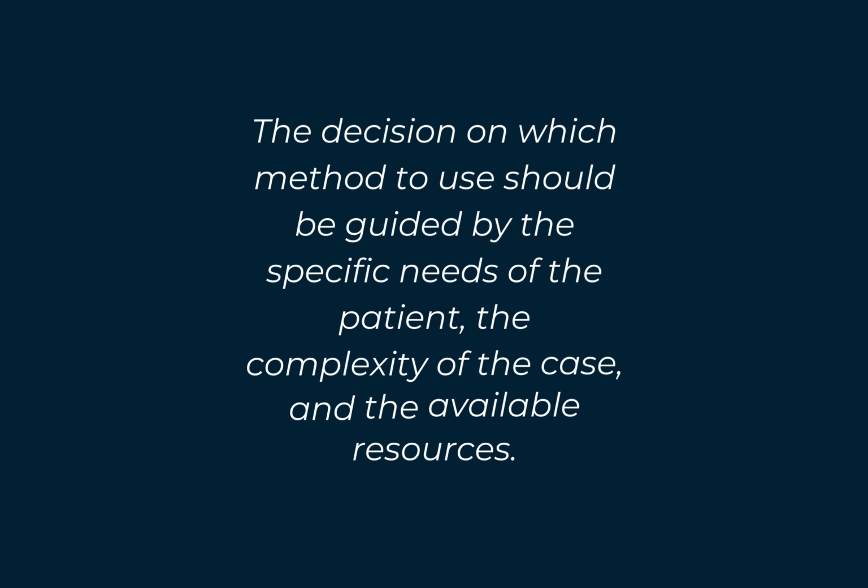The decision on which method to use should be guided by the specific needs of the patient, the complexity of the case, and the available resources.